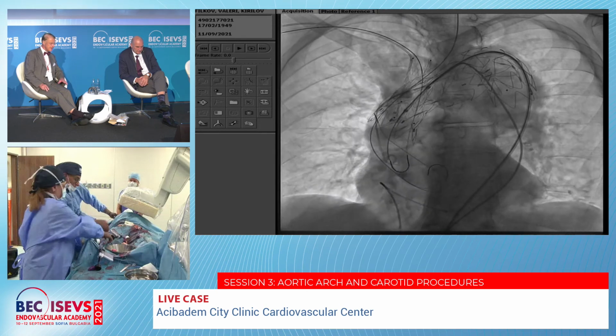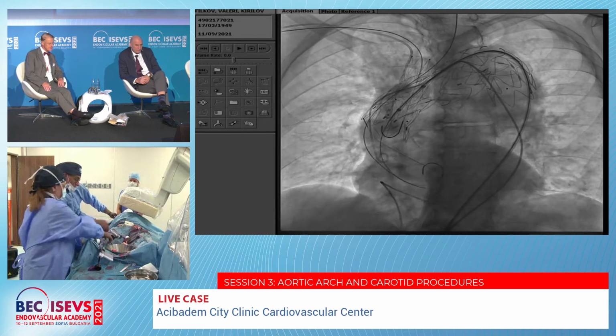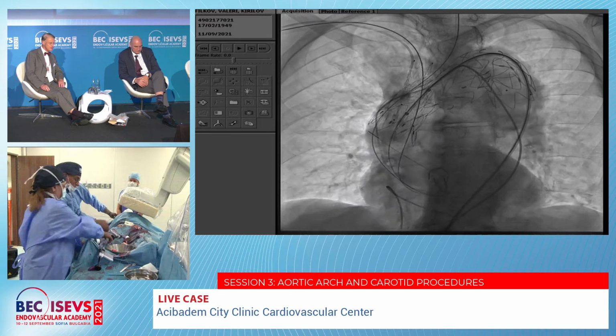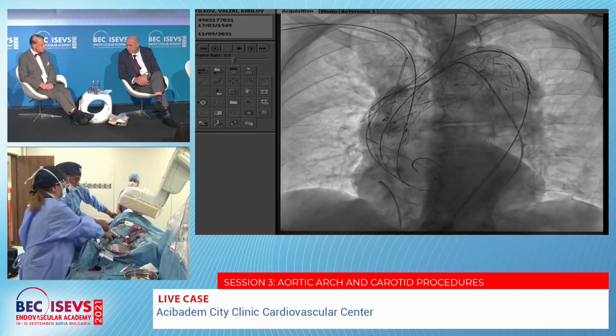When I asked, I was not concerned with the access sites, how they will close all the puncture sites, but how to occlude now the left subclavian artery, which is still connected with the aneurysm. So when you have cross flow from one side to the other, it looks like reversed flow in the subclavian, yes? You think it's reverse? At least I have a feeling it's an antegrade flow.